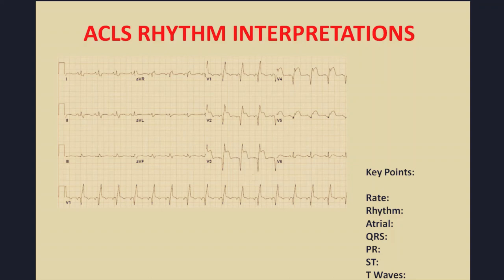So this is a case of an acute extensive anterior myocardial infarction with right bundle branch block, which carries a more serious prognosis compared to patients with just anterior myocardial infarction without right bundle branch block.